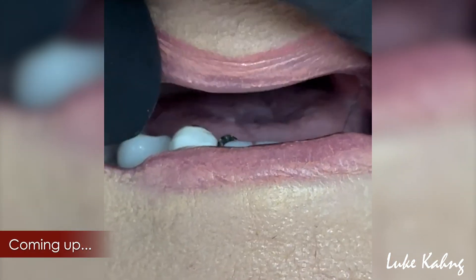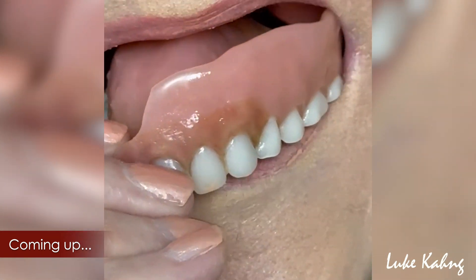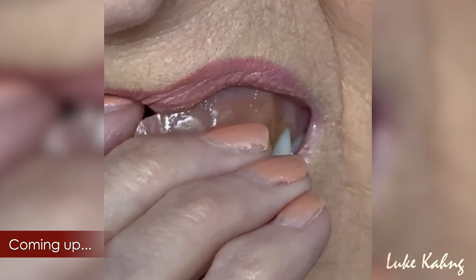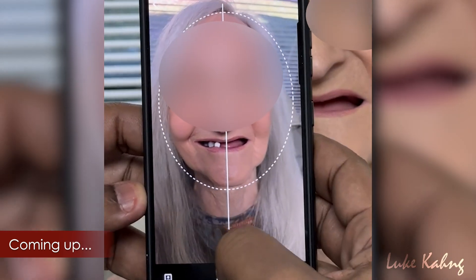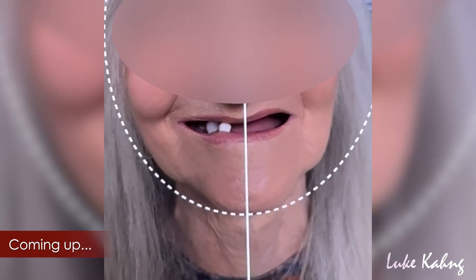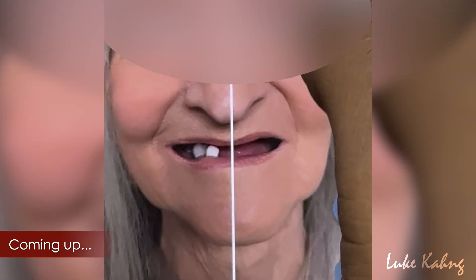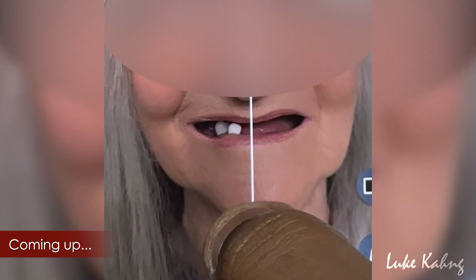Alright, okay, try it. Are you comfortable with this? Okay, take it out. That was pressure — okay, are we talking about dental pressure? Can we get a little bigger smile? Let's check the midline. The horizontal line as well. Like she said, the two seats are a little moving — change it. Okay, that's good.